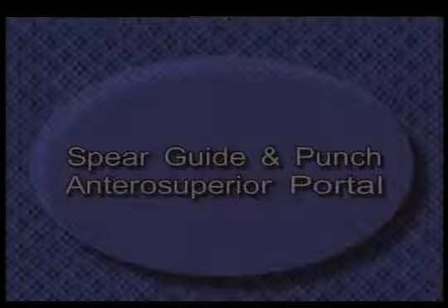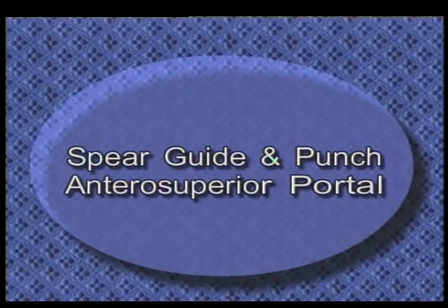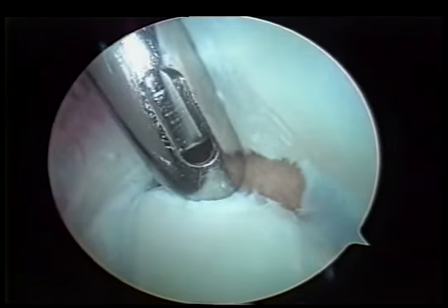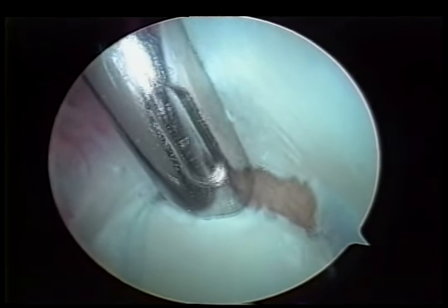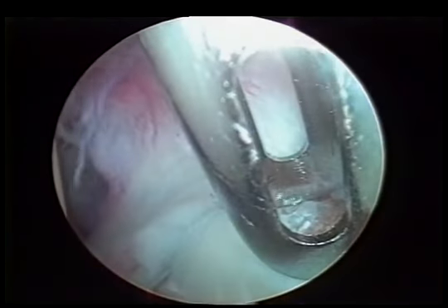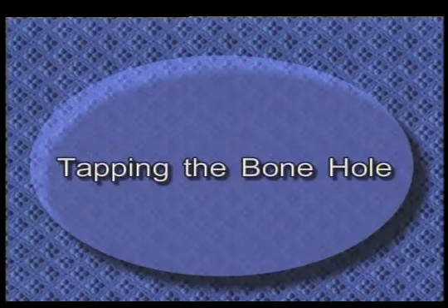Now we're ready to place the anterior anchor. We'll use the spear guide and punch to make a pilot hole coming through the anterosuperior portal. Here's the spear guide. We have a trocar punch that we tap down to the shoulder of the punch to create the pilot hole, angling toward the glenoid bone so that we don't enter the interface between cartilage and bone.